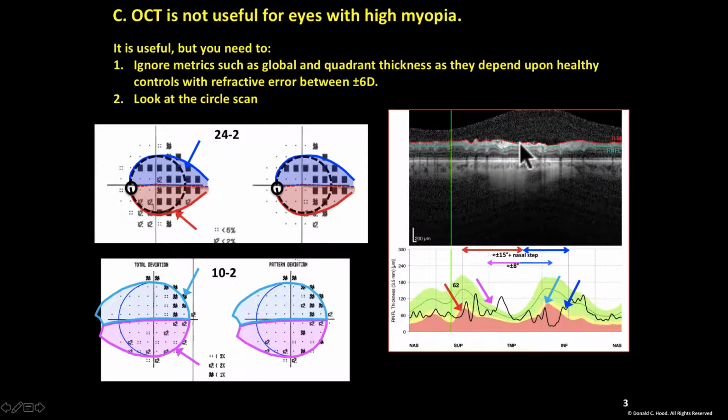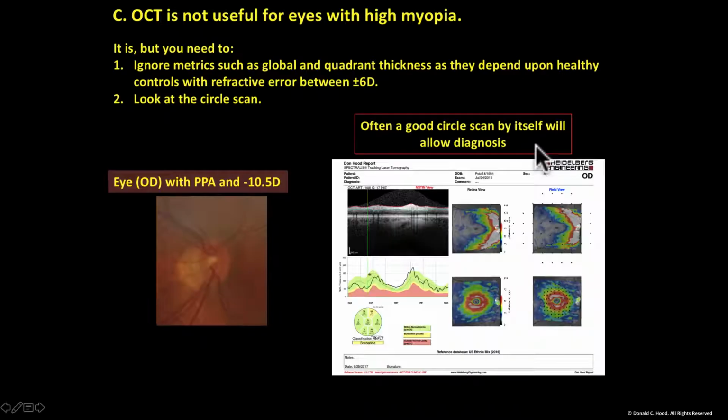Right, which again, you can see the details that you can follow over time. So often a good circle scan by itself will allow diagnosis.